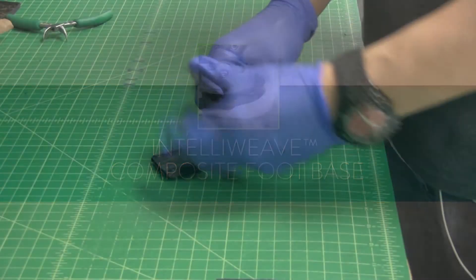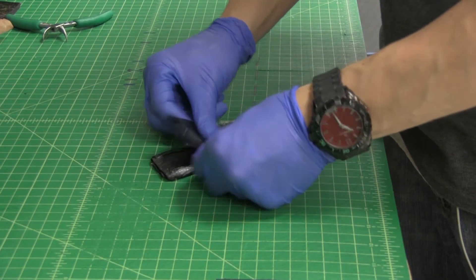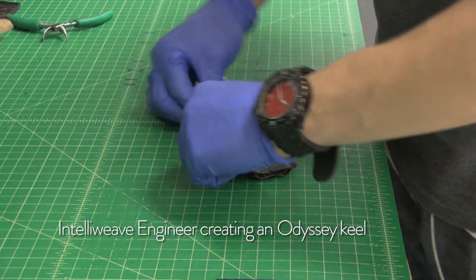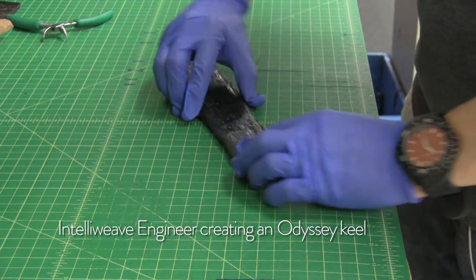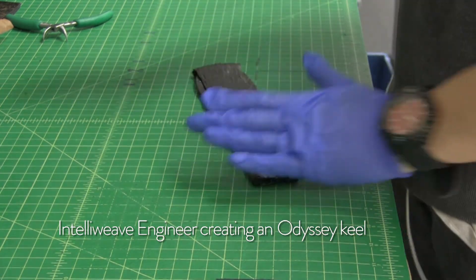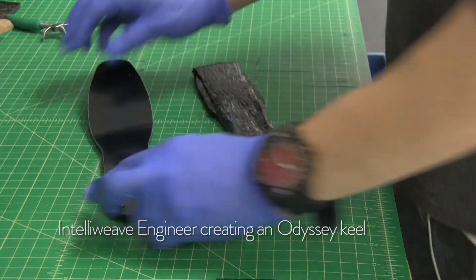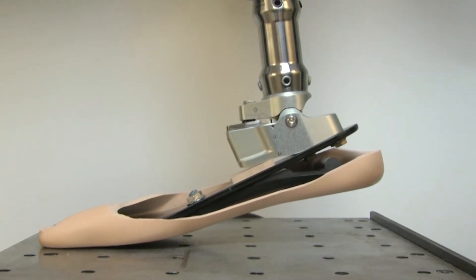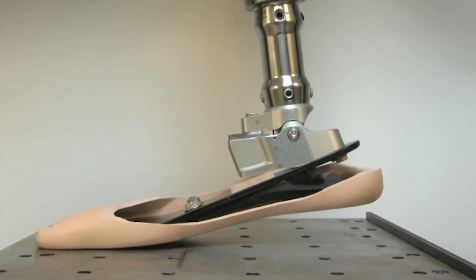Unlike other hydraulic K2 feet that only have a plastic keel, the Odyssey K2 has a full-length foot base made of College Park's Intelliweave composite material. This provides perfect gait match movement, increased ground contact for stability, controlled energy, and a flexible heel.